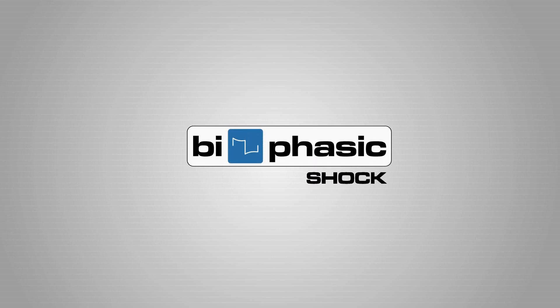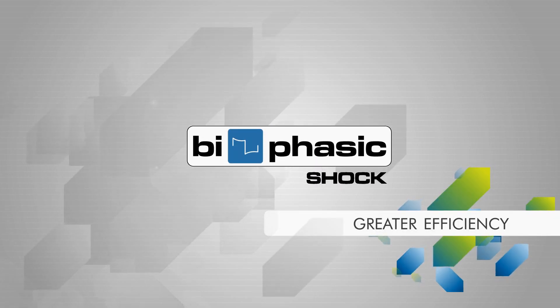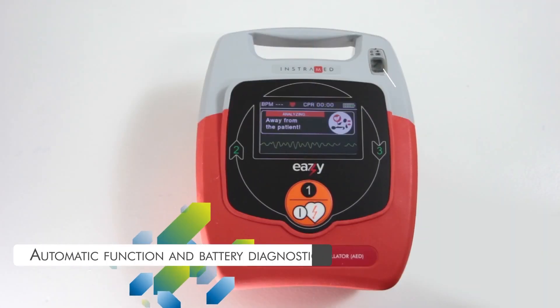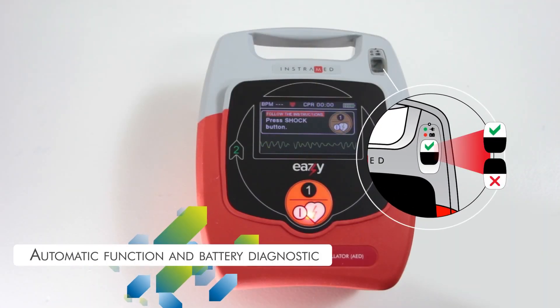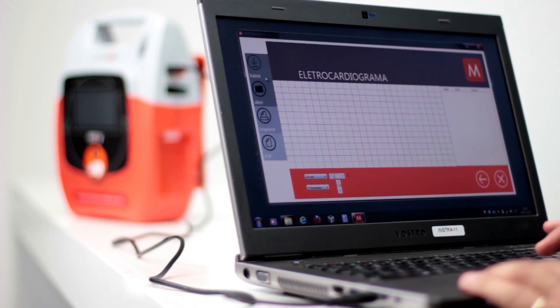Two-phase shock provides greater efficiency of shock treatment. The ESIS also features automatic function and battery diagnostics, and a PC connection that allows the user to visualize events recorded in the internal memory.